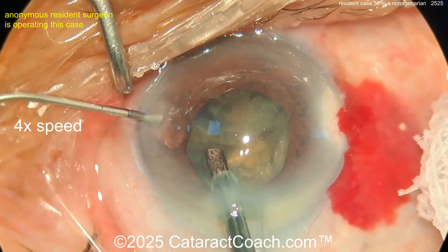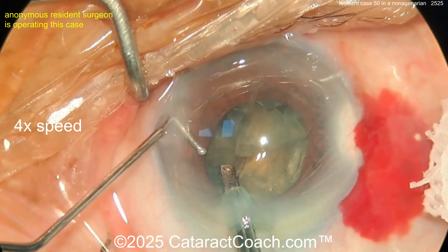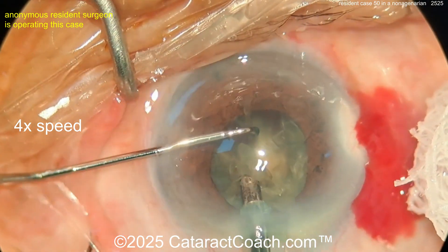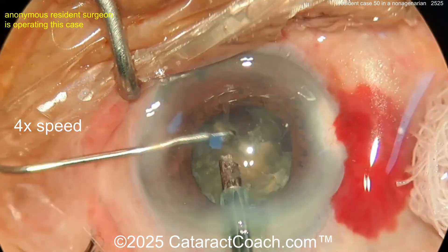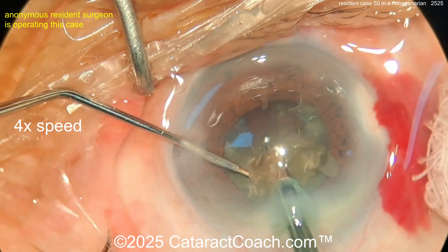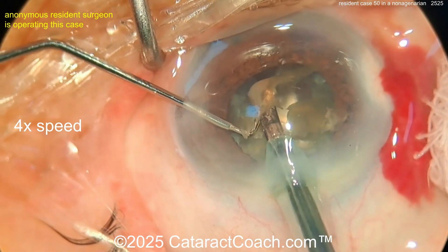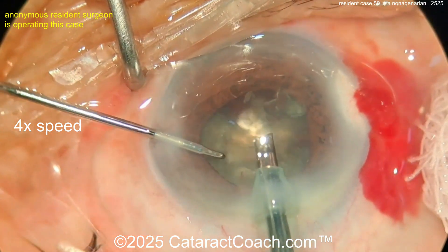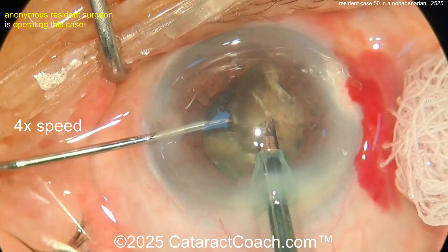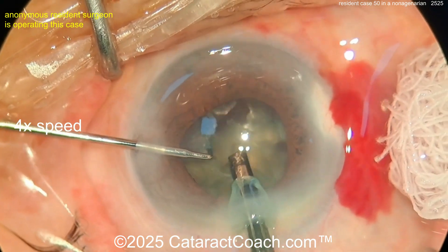Why would you sit superior instead of temporal? Sometimes it's how your professors teach. If you're doing case 50, you're obviously being taught by a professor. I prefer sitting temporal — it gives better access. Remember, the temporal limbus is farther from the visual axis than the superior limbus, which is very close to the visual axis. Some people sit superior because it hides the incision under the eyelid, but with a nicely constructed incision that shouldn't be an issue. Temporal is my preference.